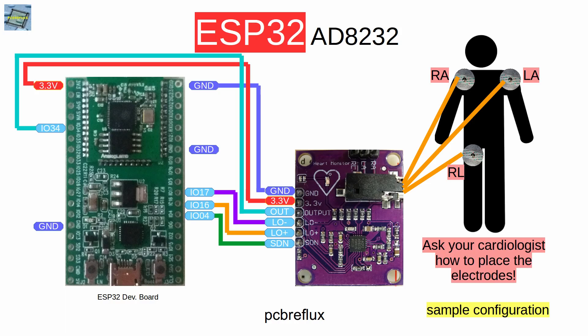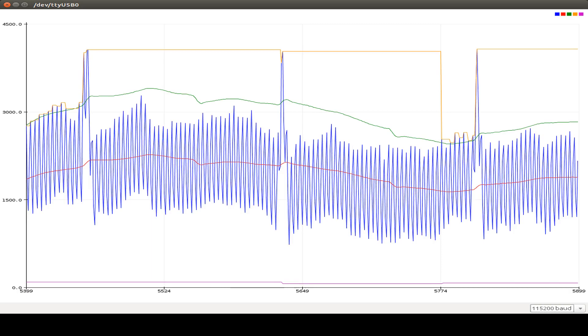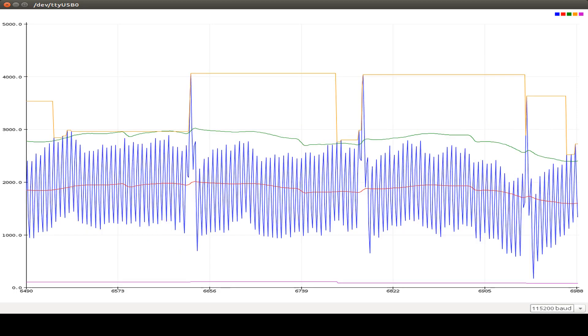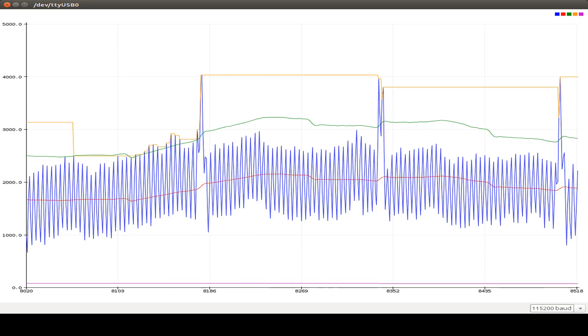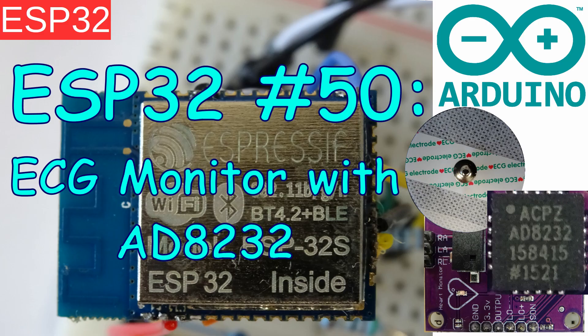Today I want to talk about the ESP32 and a heart rate monitor solution I recently saw on the Volt Lock channel. It uses the AD8232 chip from Analog Devices and came with a module. I also ordered some electrodes to work with the monitor. The whole module is based on an open source design from SparkFun, so the one I ordered from AliExpress is just a clone of the SparkFun module.